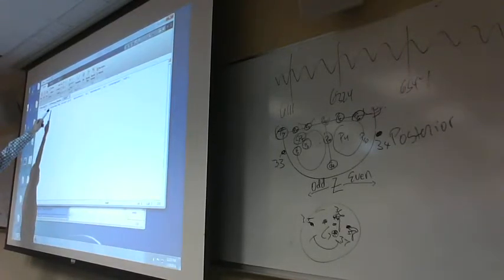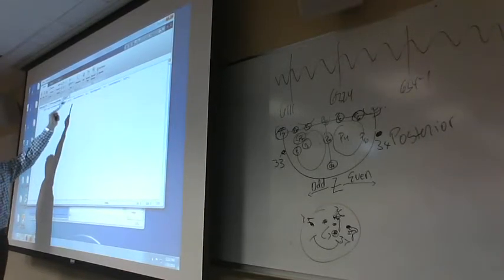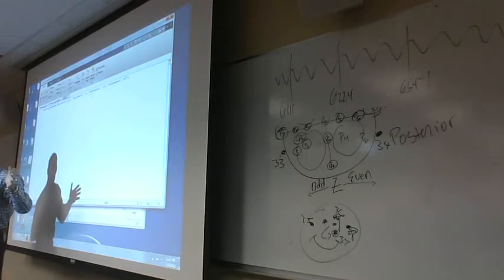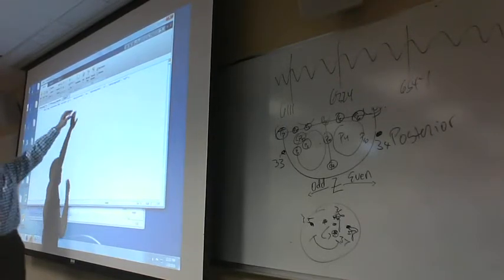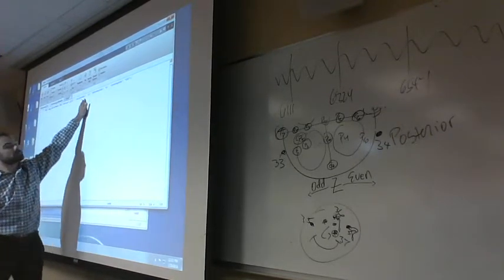Now what this is saying is we're going to select these events within the EEG that are numbers 1 through 5. Those are all of our button presses. You don't care about the button presses. Okay? And we're just going to delete those. Delete these events. Okay?